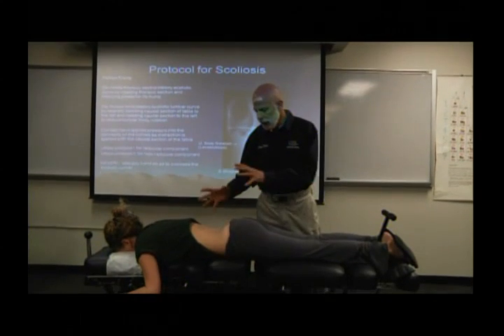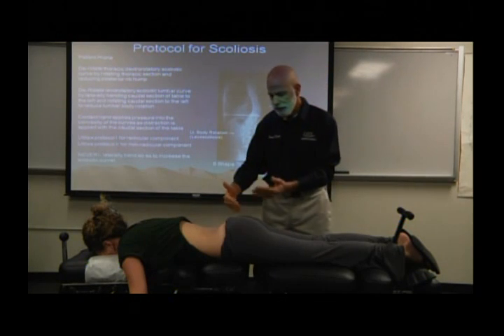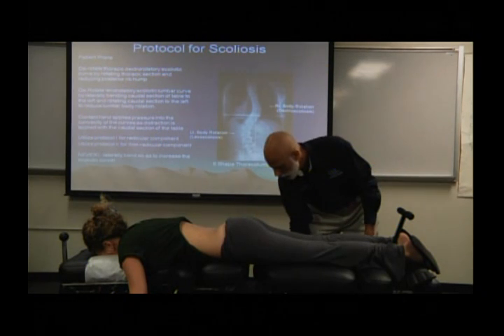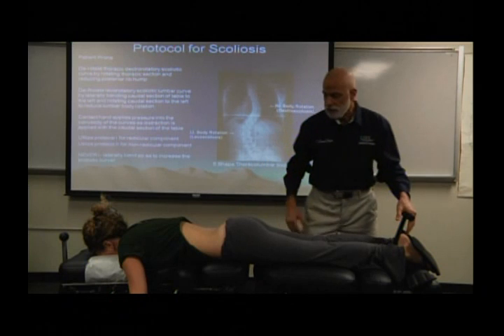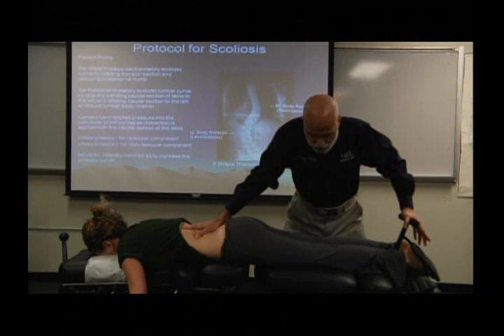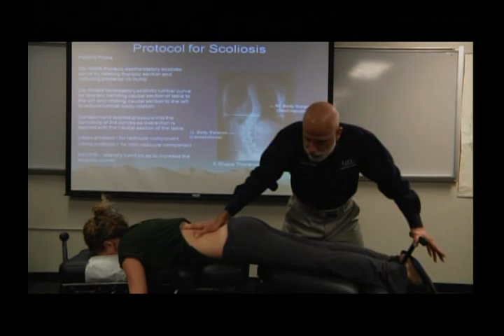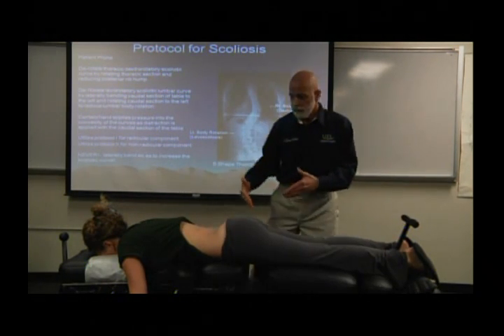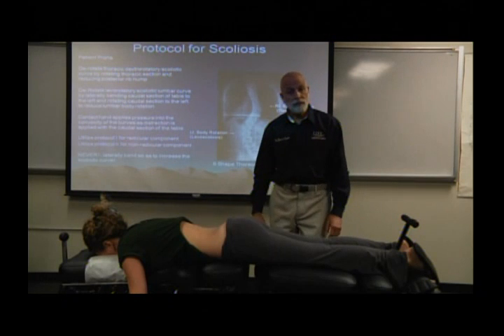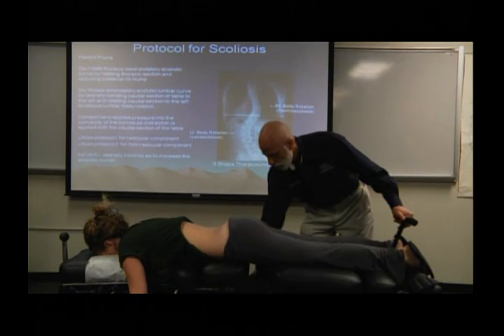And then we can go ahead and just use our standard protocol 1 on whichever vertebrae may be involved, whether it's L5 or L4, those are typically the two most common levels. We would just do your standard protocol 1. It's just that the table looks a little misconfigured, but if it was an L4, we would get over the patient just like we would for standard protocol 1, find the barrier of elastic resistance, and do your 5 4-second pumps. You do that 3 times. The only thing that we've done is we've leveled the vertebral end plates. We're going to get a lot more effective distraction to that disc by doing that. So that's the first application for a scoliosis.